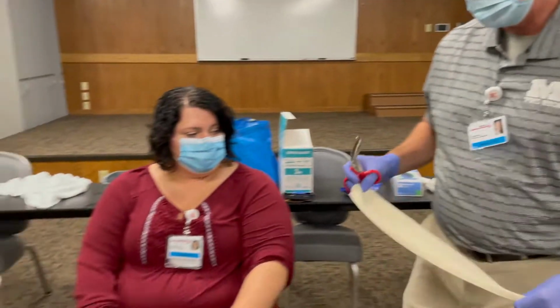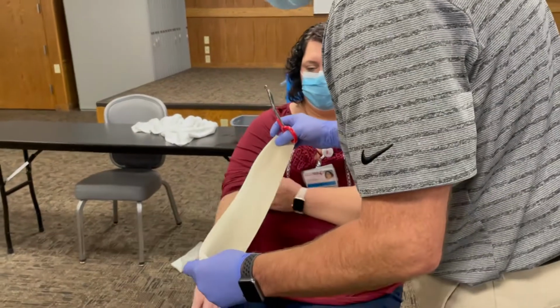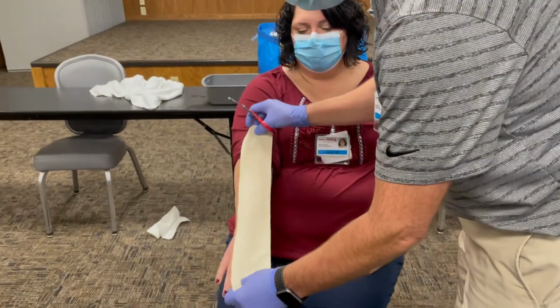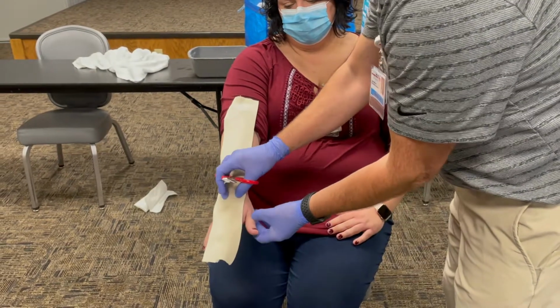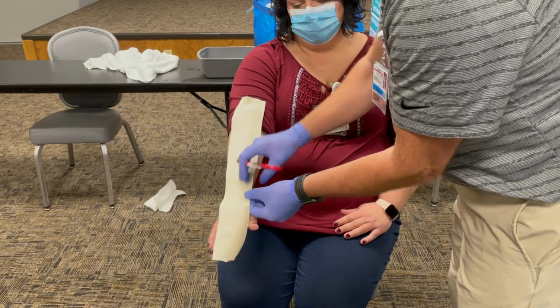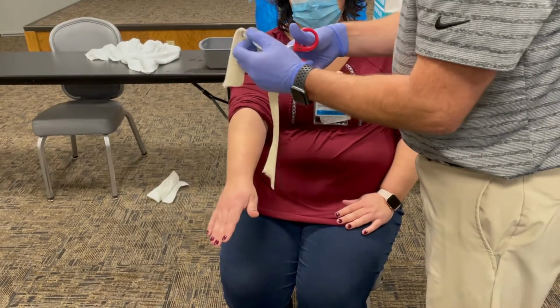And so for a volar splint, we'll do your side without the watch there. Volar splint, you're just going to cut a hole for a thumb. So I just lay that on there. And then you just kind of look and eyeball where the thumb is, right about there. And you can cut it a pretty good piece off.